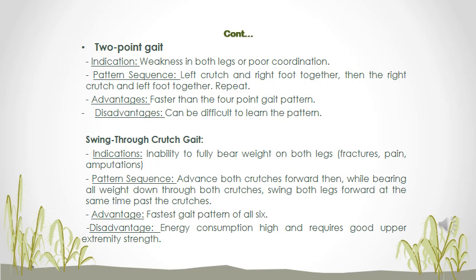What's the advantage of using this for your patient? It's a bit faster than the 4-point pattern, but the disadvantage is that it can be difficult to learn the pattern. If you have a pair of crutches at home, try it out and see which one is faster or slower, the 2-point or the 4-point gait pattern.